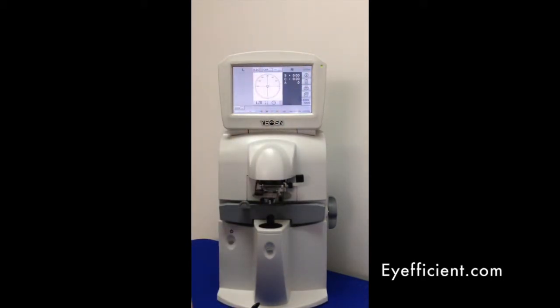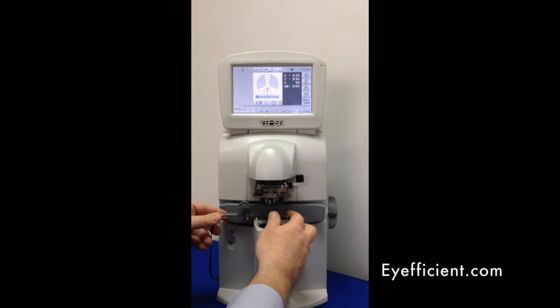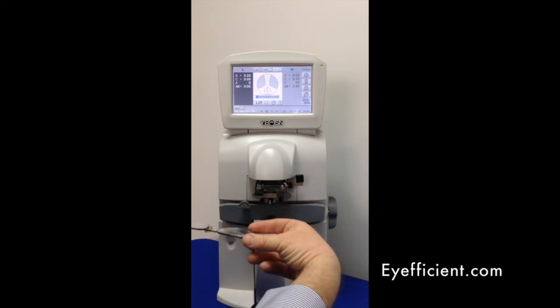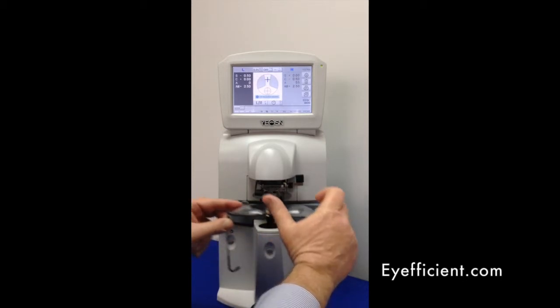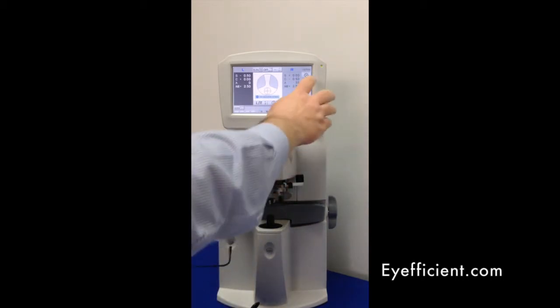Now let's measure a pair of progressives. I'll put the right eye of the progressive lens in — notice the software recognizes it's a progressive. I go up to grab the distance, move up the channel, and place the plus over the plus. Sometimes it reads automatically; if not, you can press the button. Move to the other eye, measure the distance, go up the channel, and put the plus over the plus — either wait for automatic capture or press the button yourself. The instrument auto-detects it as a progressive. I'll delete that now.